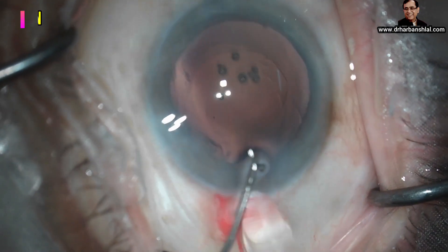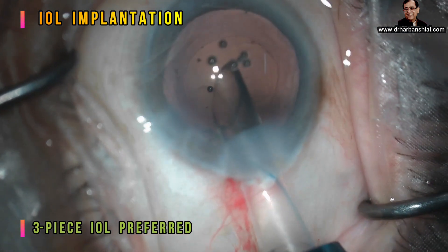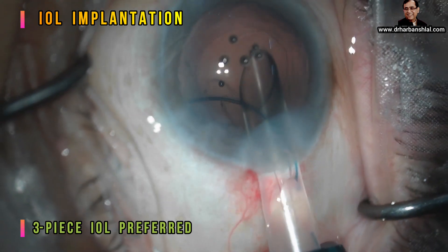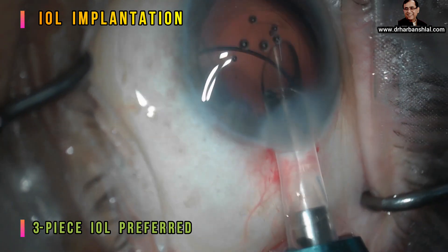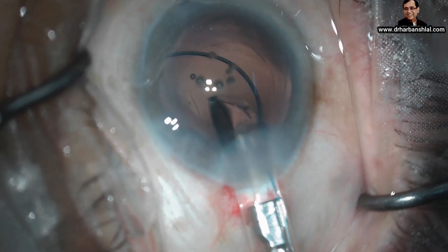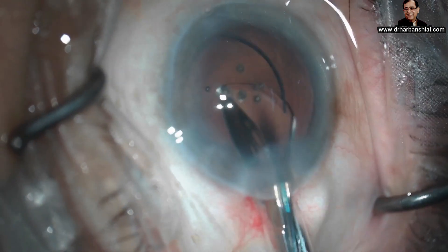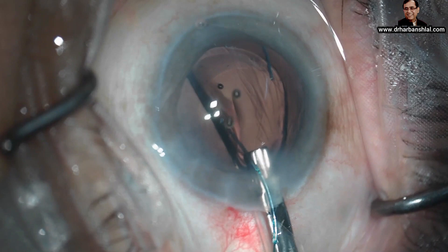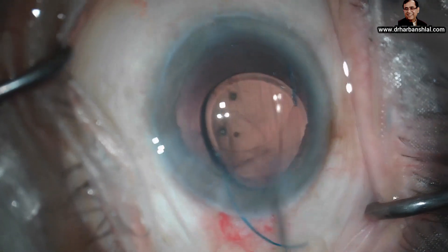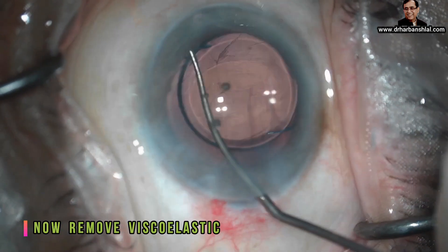We have implanted a 3-piece IOL in this case, as 3-piece IOLs are the preferred choice in patients with PCT because the tear may get enlarged and therefore 3-piece IOLs can be placed in the sulcus if needed. But here we are implanting the IOL into the bag as the hyaloid face is intact and there is no vitreous prolapse into the anterior chamber. Put the trailing haptic in the bag, then remove the viscoelastic along with any remaining cortical fibres.